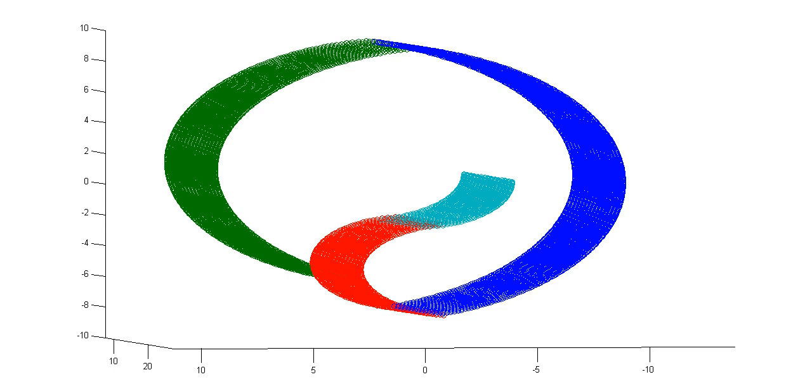So there's this trade-off: you might miss things that are really there if you're too conservative. But if you're insufficiently conservative, you're going to assert that lots of things are true that are not in fact true. So this is a trade-off that people doing these kinds of data analysis have to dance around. And given that there's judgment and discretion in this level of conservatism, there's a risk that people will err on the side of overly optimistically interpreting things. That's a political way to put it, overly optimistically interpreting.